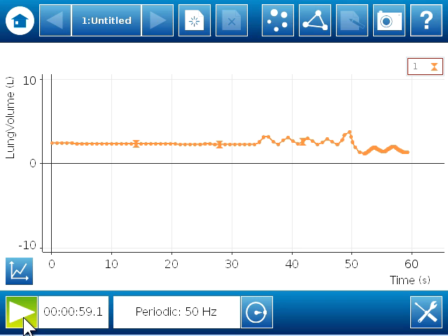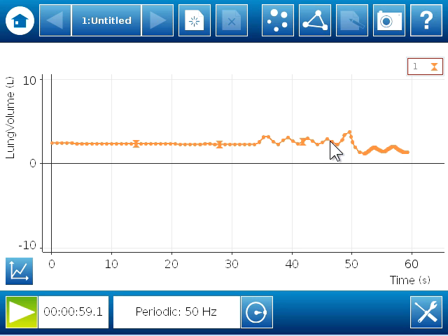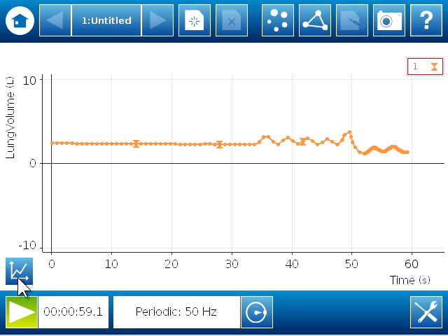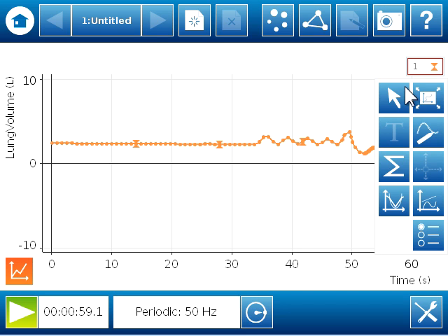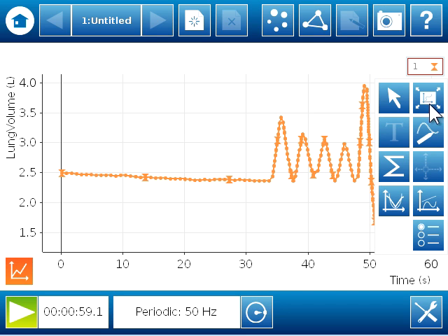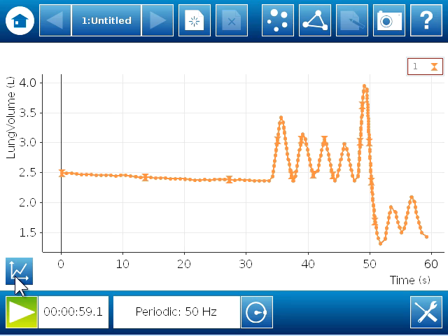So you can probably see on the graph display, at about 35 seconds, I started to breathe through the mouthpiece. And you can see the lung volume change as a result of that. But in order to get a better view of the data, I'm going to use my graph tools and the auto scale.